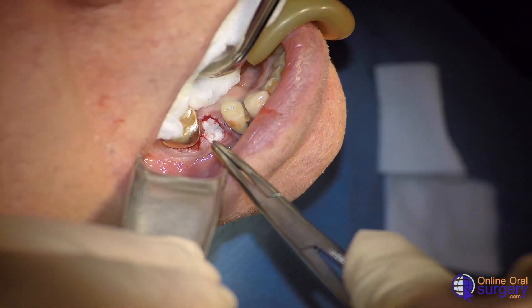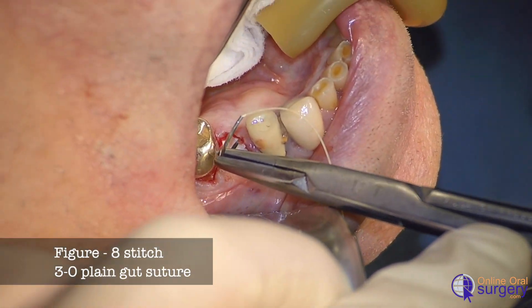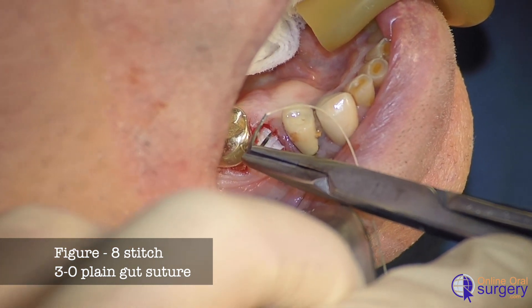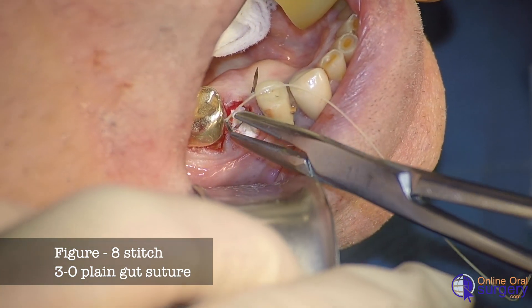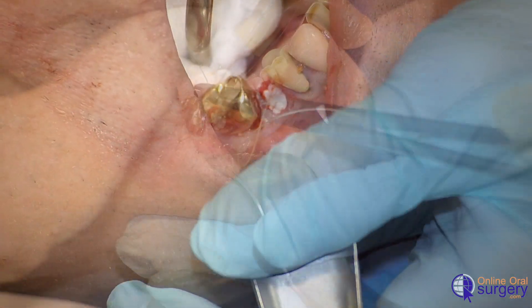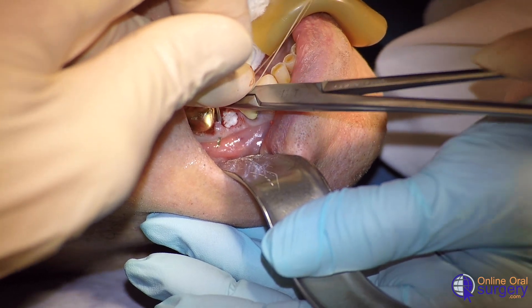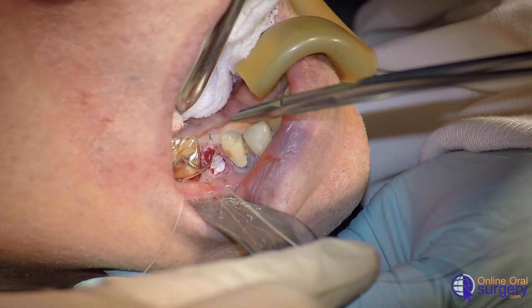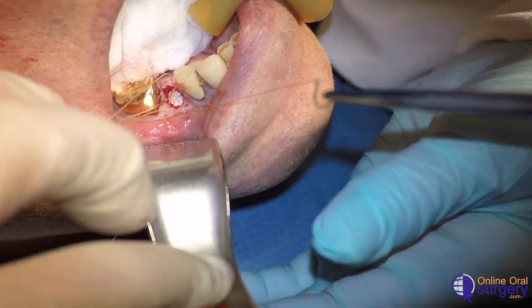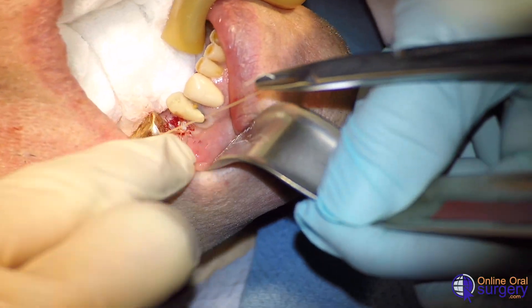I'm going to take my gut suture and start on the lingual aspect, going from the inside of the socket towards the outside on the lingual, and then come back on the facial. The reason I go from the inside to the outside is so that when the needle is passed through the mucosa, if we were to go from the outside to inside, we'd be displacing the gel foam, which I don't want to do. In this instance, we're actually pulling it down a little bit more. Now we've got our figure-eight suture completed with the gel foam in place.